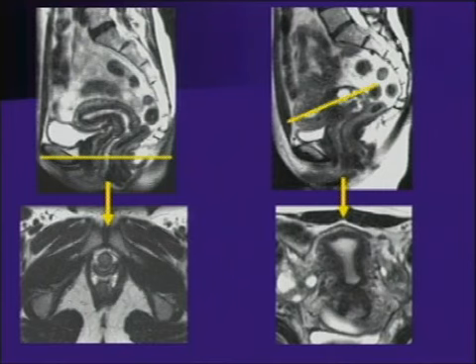So here's an example of a patient where, in this particular exam, we may be looking at the urethra. So we get an axial view through the urethra, try to cut our plane perpendicular to the urethra to get good axial views to see the normal bullseye appearance of the urethra, the normal W or H shape of the vagina and rectum, as well as to look at the levator musculature, which will play a role in dynamic pelvic imaging. If, for example, in this case, we're trying to look at the uterus itself, we cater our exam to this particular uterus, which is anteverted.